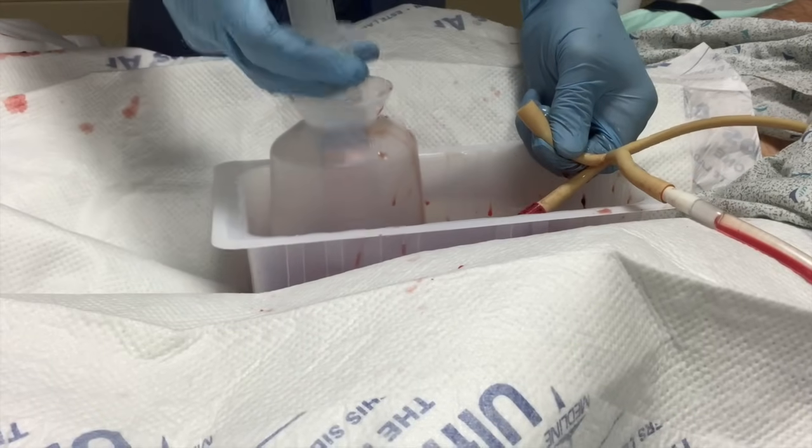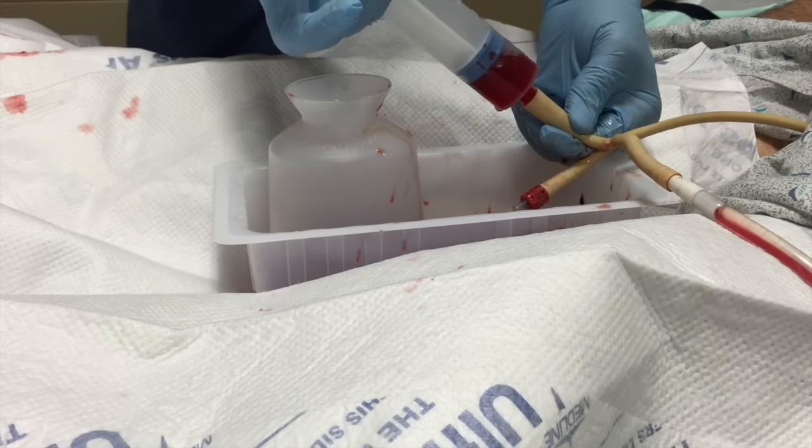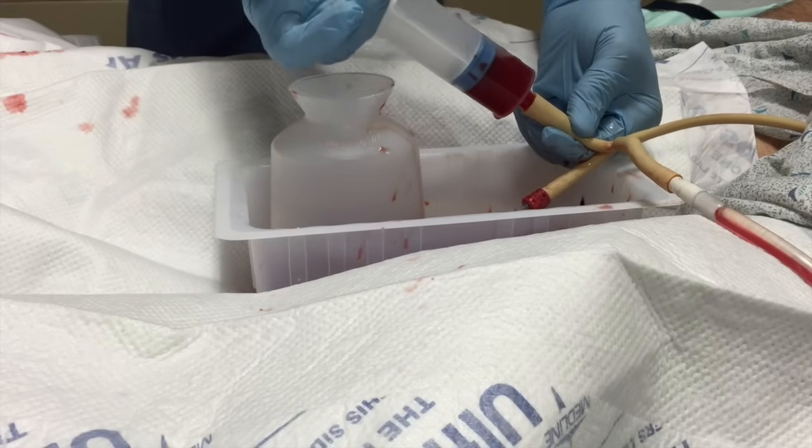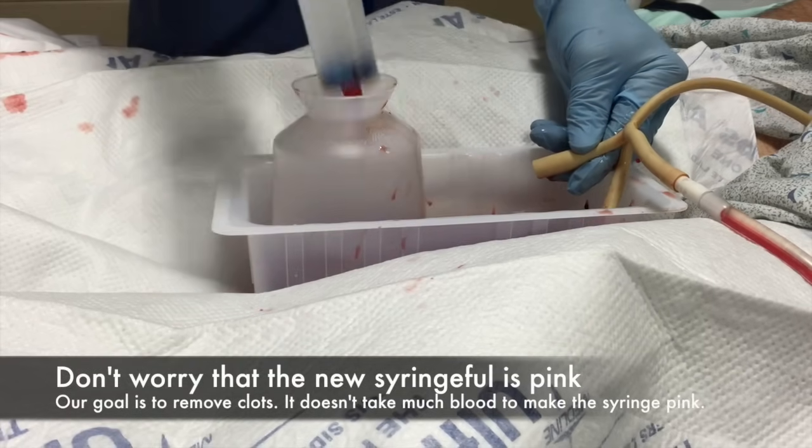We do not use saline as it does not lyse the cells as well as sterile water does, and these clots are generally inches in diameter and need to be shredded in order to get out the rather narrow tip of the catheter.